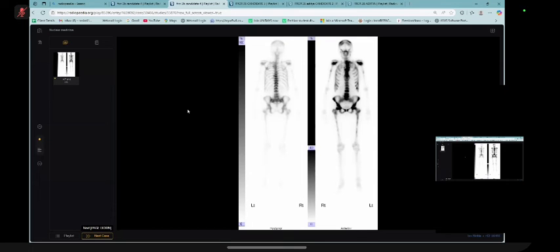Okay. Yes, sir. That was the learning point out of this. Otherwise, everyone will say this is bone pain, so metastasis, as you have said. But once you look at the previous images, I will say, yes, there is a breast cancer in the previous images. Then you can say that it could be that, and you can send the patient for maybe a PET scan or MDT, something like that.